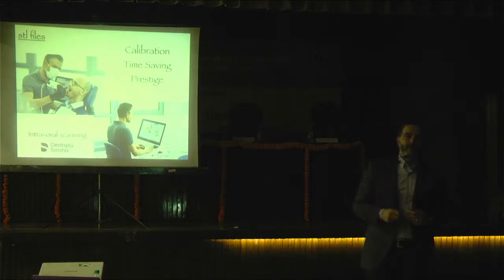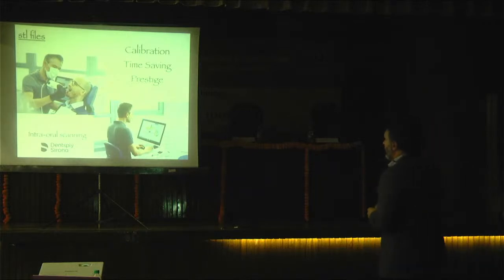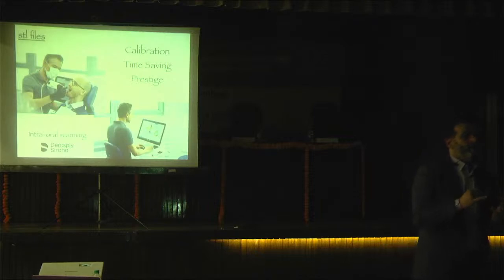The second thing, the STL data. How do we do that? We do it by intraoral scanning in our clinics. But you can do intraoral scanning, or you can do an impression, a conventional method of getting the impression.